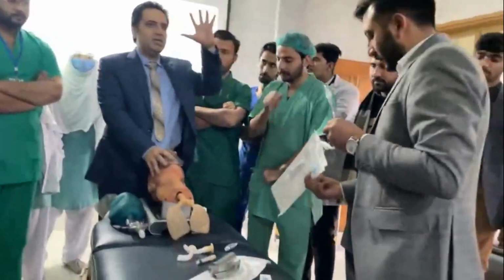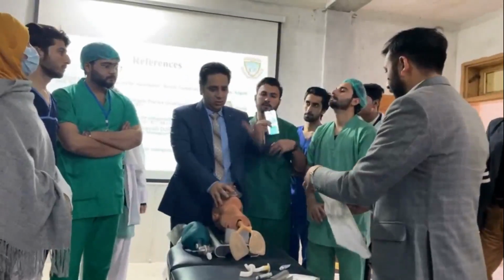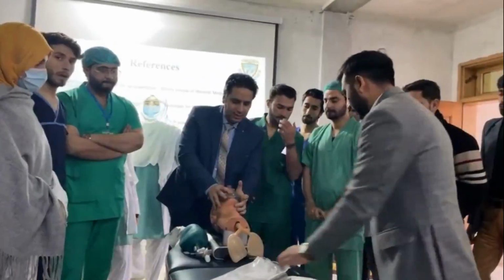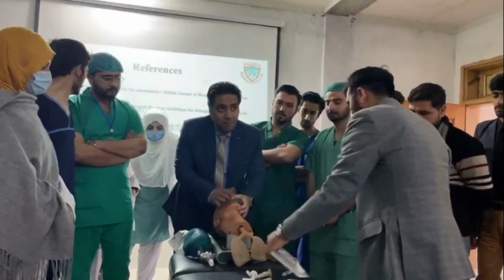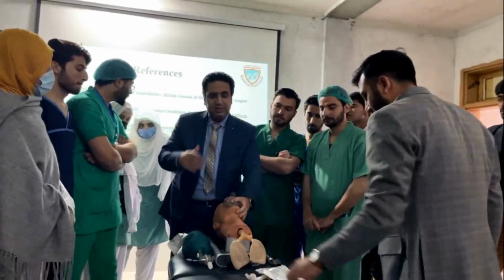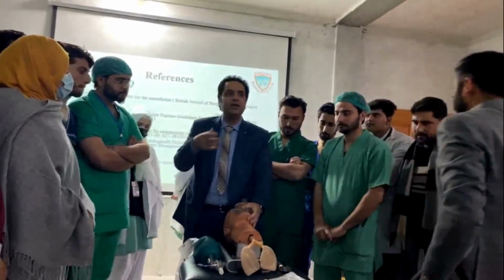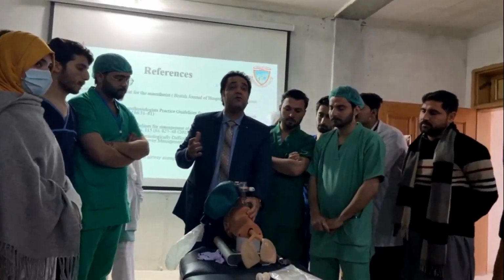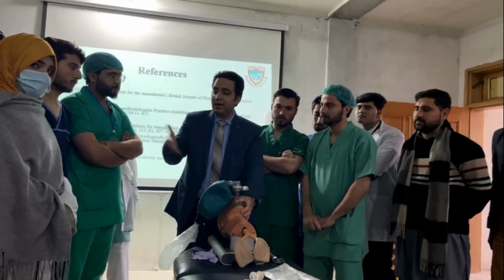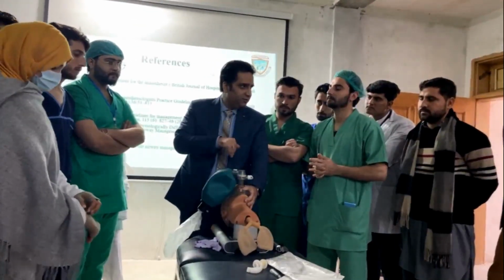And this is the CE technique they told you. This is a C, this is an E. So you put the E inside the mandible and you put the C over the mask. This is a single-hand technique. A single person, up till now you don't have any help. No assistant is here, you are just alone for this difficult intubation.